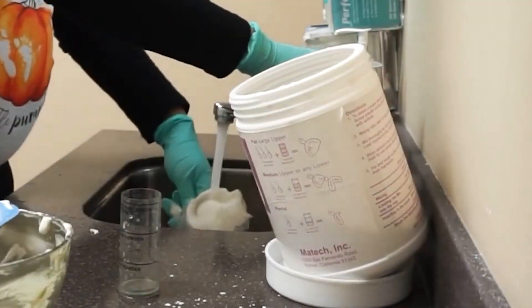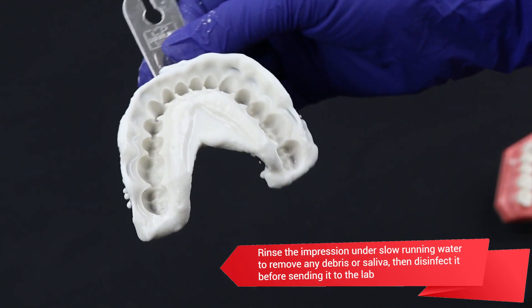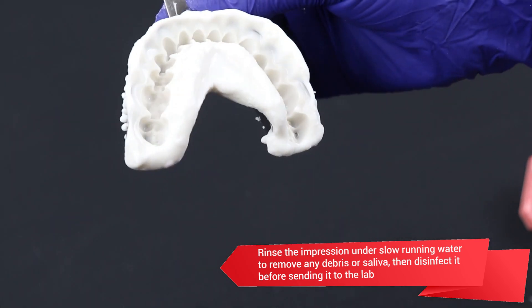Rinse the impression under slow running water and remove any debris or saliva. Then disinfect it before sending it to the lab.